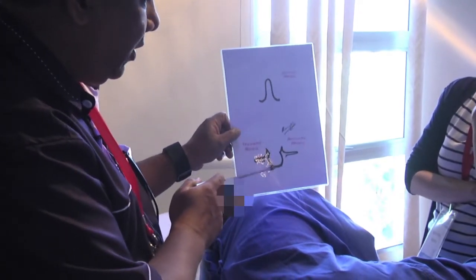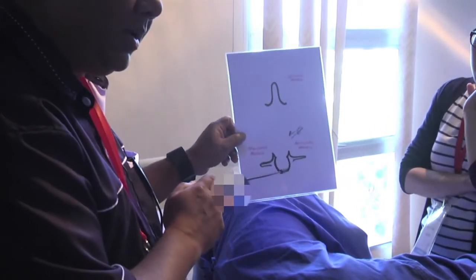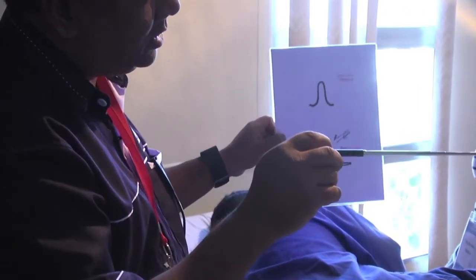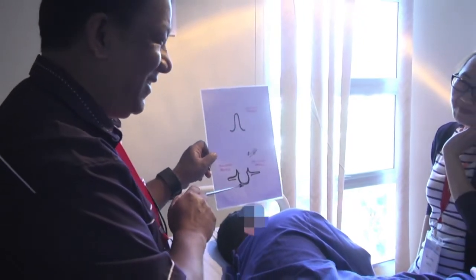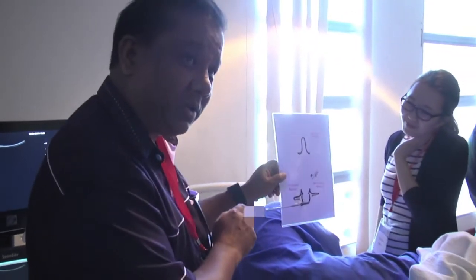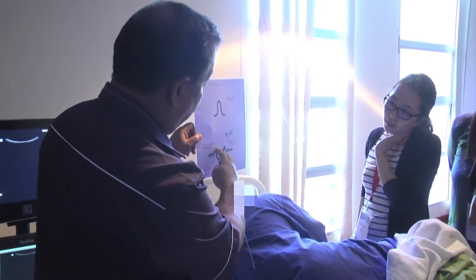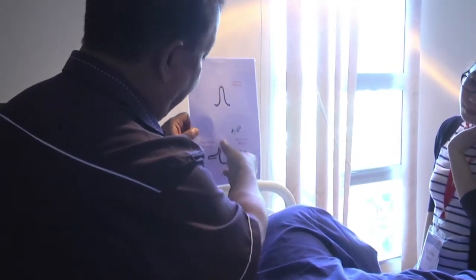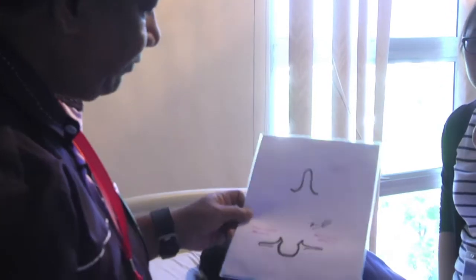This can be used to see if there's any asymmetry in the vertebra. Like your ears are very symmetrical. If your ears are not symmetrical, you have torticollis. But if this is asymmetrical, that means there is a rotation in the vertebra. Say, for instance, it's like this, then you know there is a clockwise rotation. If it's like that, then you know there's an anti-clockwise rotation. But your scan has to be correct.